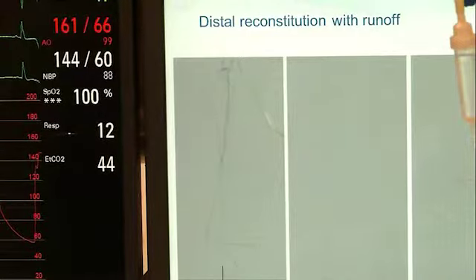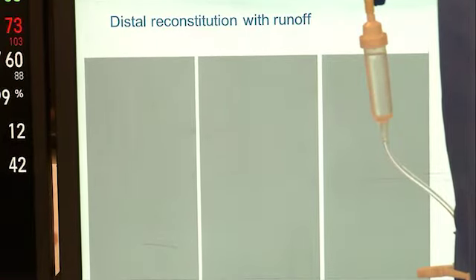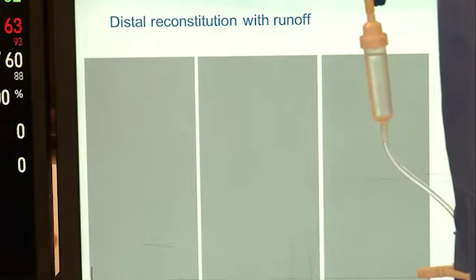Next slide. So he had prior angiography. So this is selective angiography of the right common femoral artery. As you can see here, we demonstrate the occluded SFA, both in the RAO and the LAO projection. Next slide. Video on the left here is reconstitution. And as you can appreciate, there's actually 2 areas that are CTO. Next slide will play the 2 following videos. The middle and the third panel there. So again, you can see the runoff with reconstitution into the popliteal, which has significant disease distally just prior to the origin of the AT.